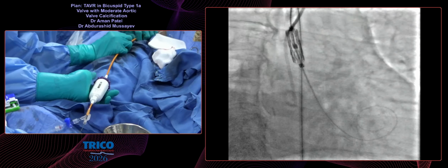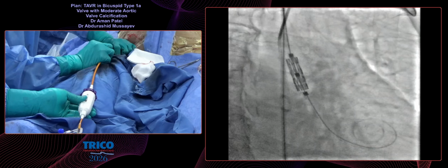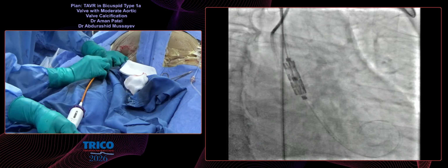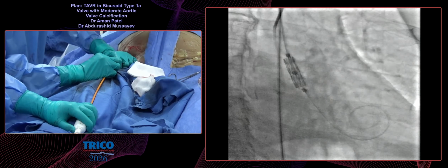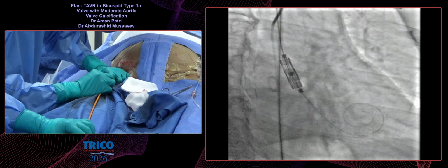We want to avoid touching it because there might be a lot of atheromatous plaque that you don't see on X-ray. Would you go in one swing across the valve, or stop in the ascending aorta and then cross again? Yes, we stop in ascending aorta.